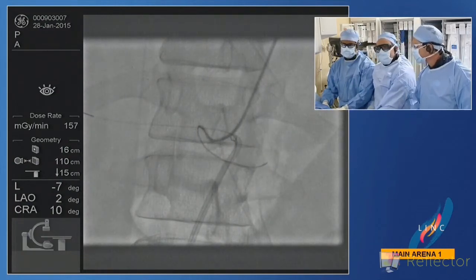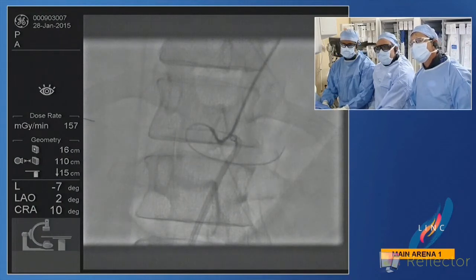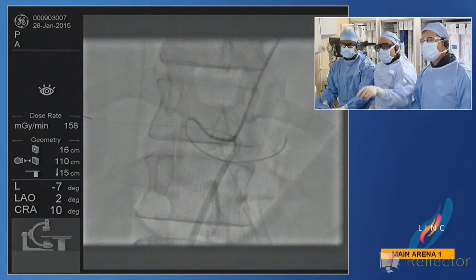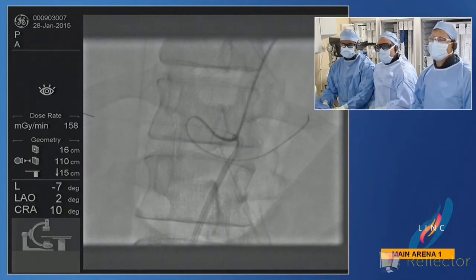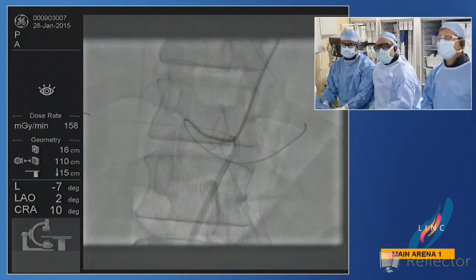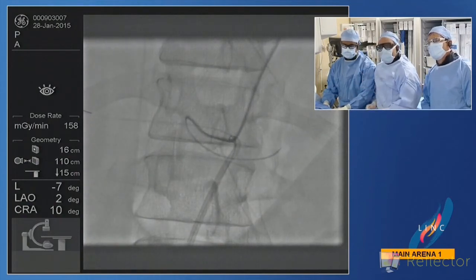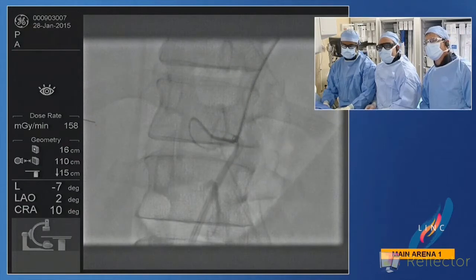What catheter do you have there? This is a Cerebral radial catheter. Okay, so they have a radial catheter you get here. It should be enough. We've been picking up our experience with transradial interventions for a variety of things, not as much for peripheral arterial disease other than iliacs. There was a big push for that, but I'm not convinced. But certainly, I think so. What are you doing?